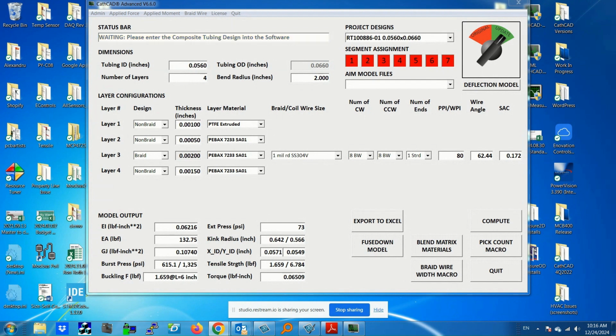Again, entry takes about a minute or less. And at that point in time, when you're done, you can hit the compute button, and there's our results in the lower left-hand corner. So basically, we have our flexural rigidity, longitudinal rigidity, torsional rigidity, burst strength. People look at kink radius, and then all your various tensile strength and torque capabilities. Okay. So very, very simple. And then, instead of having the user have to write everything down, there's this export to Excel button. So we click on that. And the first time takes a little while to do that because there's a lot of writing going on. After that, everything is pretty good.